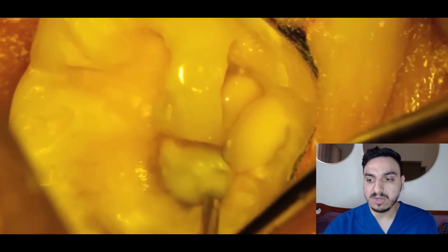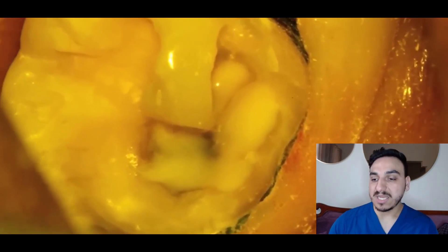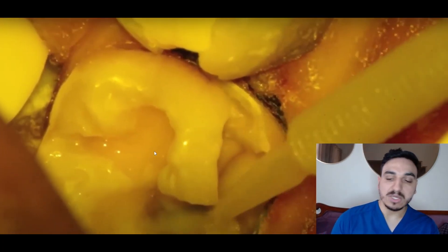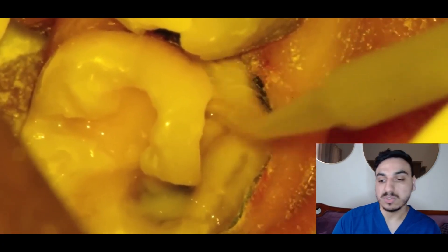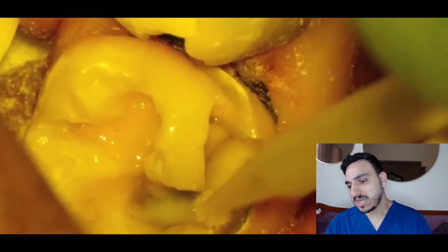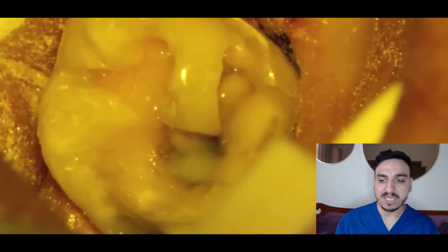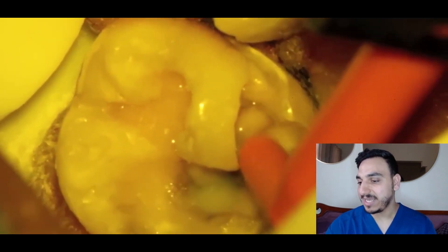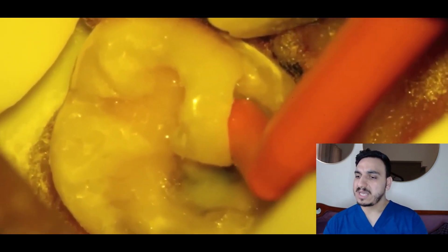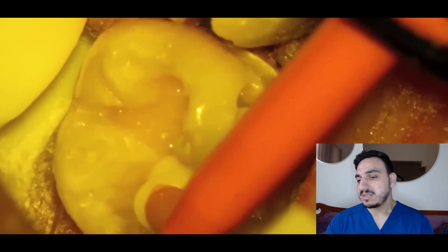They're gradually starting to insert the restorative material. They're working on the deepest areas first and will gradually progress to the rest, because the deepest areas are most prone to sensitivity in the future, so those need to be done very well. It looks like they're applying a bond or a primer — I'm not sure which system they're using, as there are different systems for composite. I assume they're placing composite at the end. They've filled the deepest areas and are now placing and adjusting the restorative material.